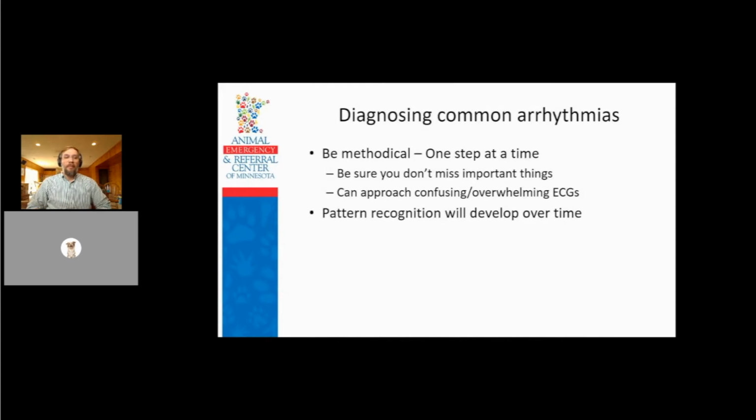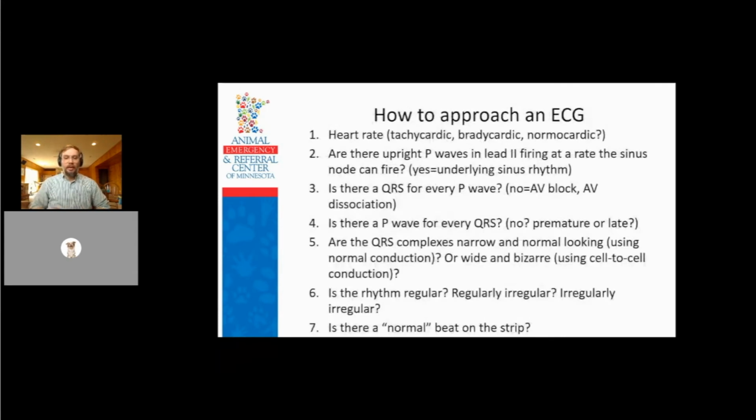When I approach an EKG, I think with anything in veterinary medicine, as we go from vet student to vet, we go from thinking through the pathophysiology when we get diagnostic results back and trying to come up with an answer, to eventually getting to pattern recognition. The more we see stuff, we recognize it, and we don't necessarily have to do that whole mental exercise of the pathophysiology. But even when you get to pattern recognition, you're like, oh, that's AFib, from across the room, I still go through these just to make sure I'm not missing it in my head. So what are these questions? So this is how I approach an EKG.